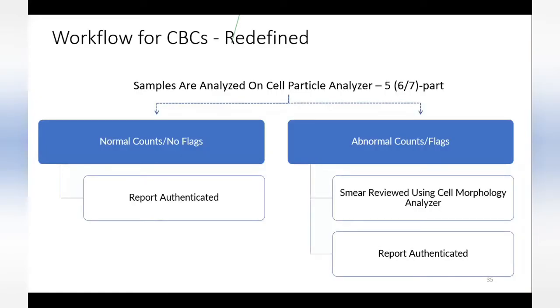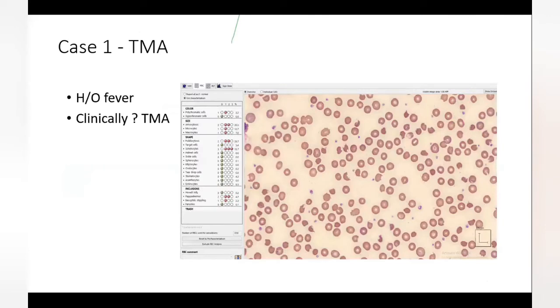So if we have to redefine the workflow, we make a small change here: instead of reviewing the smear under the microscope, we review it using a cell morphology analyzer, and then we authenticate it. Some of these cases have been directly reported. We have another 10 minutes, so I'll quickly run through the cases and see how we can use them in our day-to-day reporting.